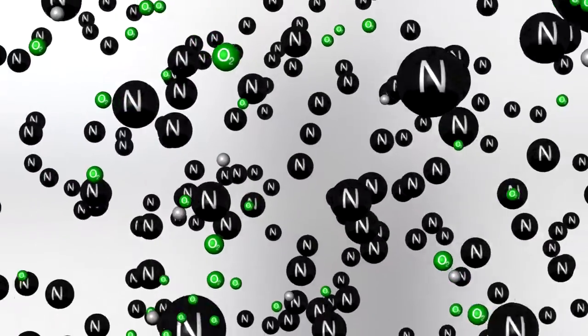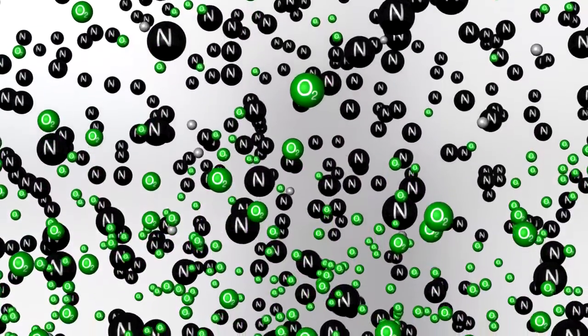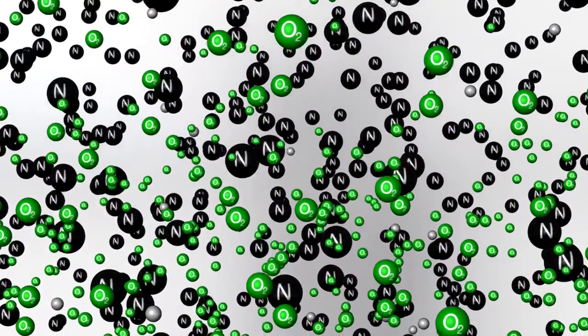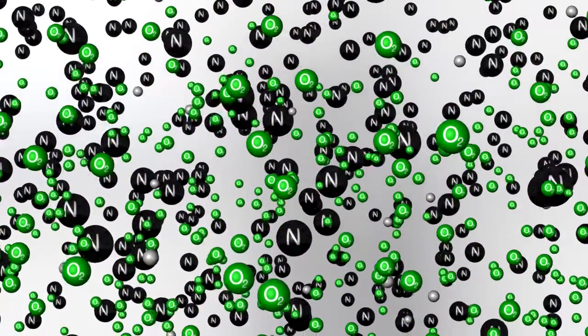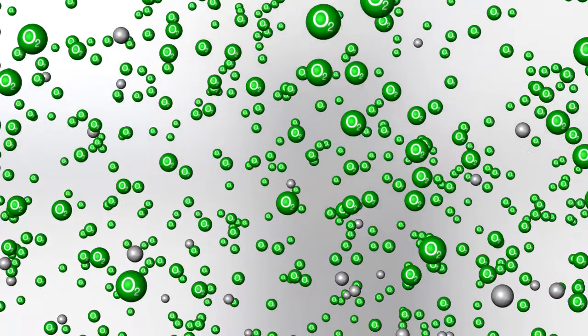Ambient air is made up of 78% nitrogen, 21% oxygen, and 1% other gases. The oxygen concentrator removes the nitrogen from room air, creating a mixture that is up to 95% oxygen, depending on environmental conditions.